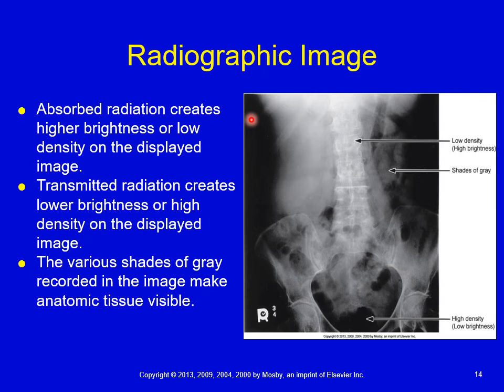All right, now I'm gonna put my... where'd it go? Mouse here, but I also want you to take note of, not mouse, laser here. Hopefully you can see this, but I also want you to take note of these air gas patterns in the bowel, these darker areas in the bowel, because air is there. All right, so things like the lungs or the bowel, when there's air within the bowel, they are going to allow the X-rays to penetrate through.